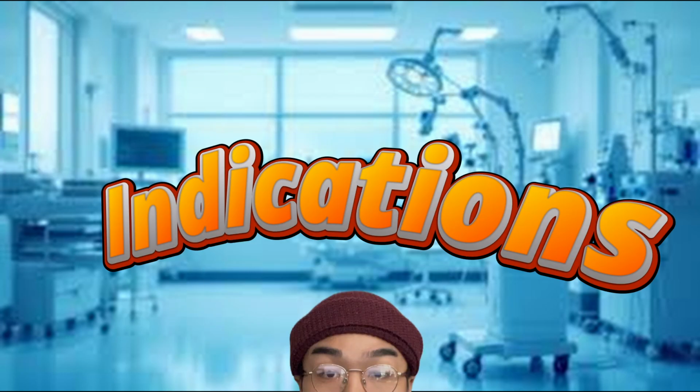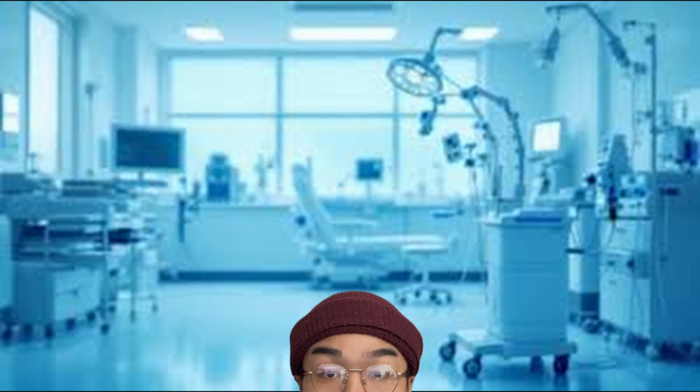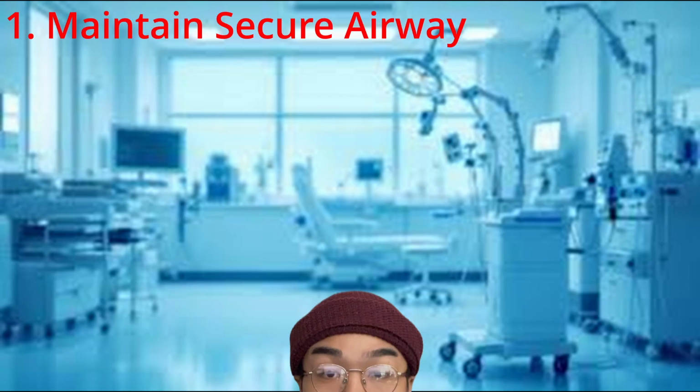So, that brings us to our indications. Well, that's not that simple. So, the first main indication is to maintain a secure airway. Like we said before, these people most likely can't breathe on their own because of some kind of anatomical or physiological problem. We're bypassing that problem through their throat.